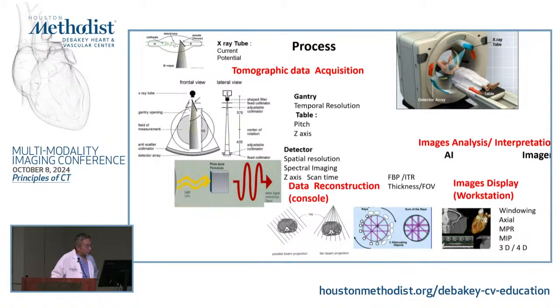So you generate this photon. We can talk about how we generate it later. It goes through some collimator so we can focus on the patient laying here in the middle. And this is going to go around the patient constantly in synchrony with the detector. So you acquire the data, then traditional CT uses a photodiode to convert the photon into an electrical signal.